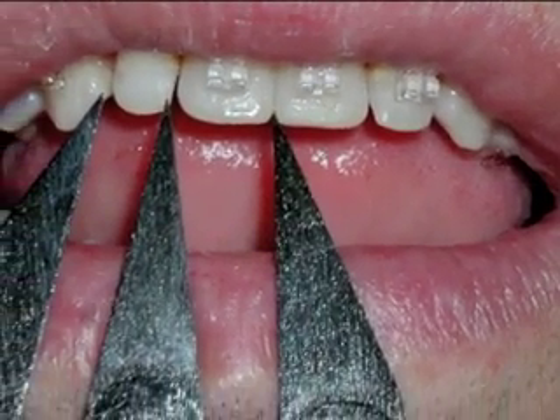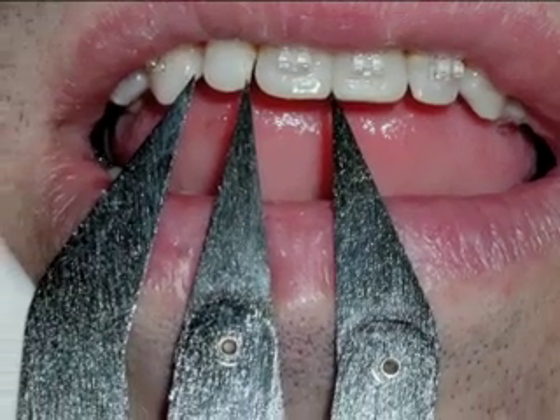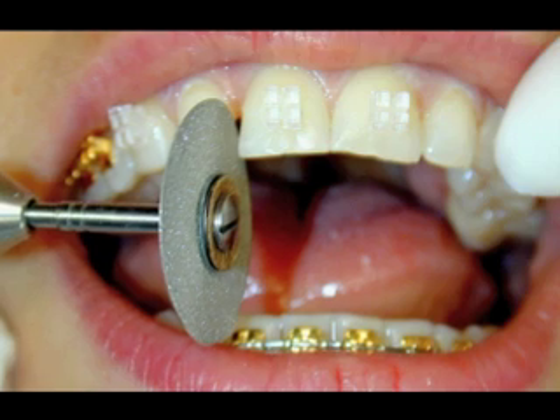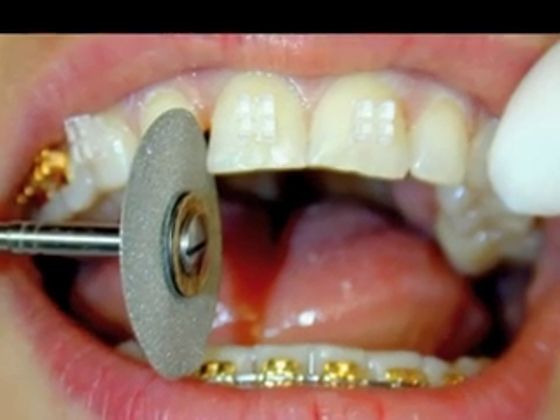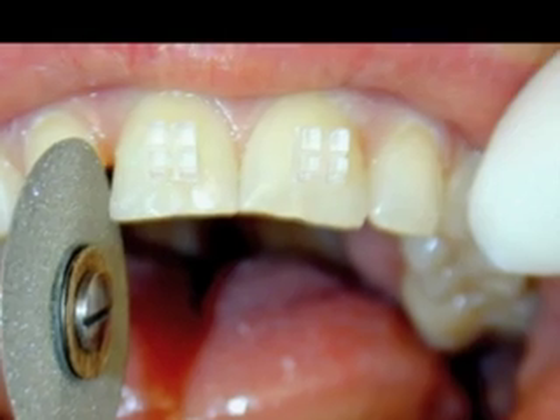This can be determined with a simple millimeter rule, or, if you happen to have one, a divine proportion caliper. We'll often reshape and size the upper central so that we can create a fuller contact with the veneered teeth.